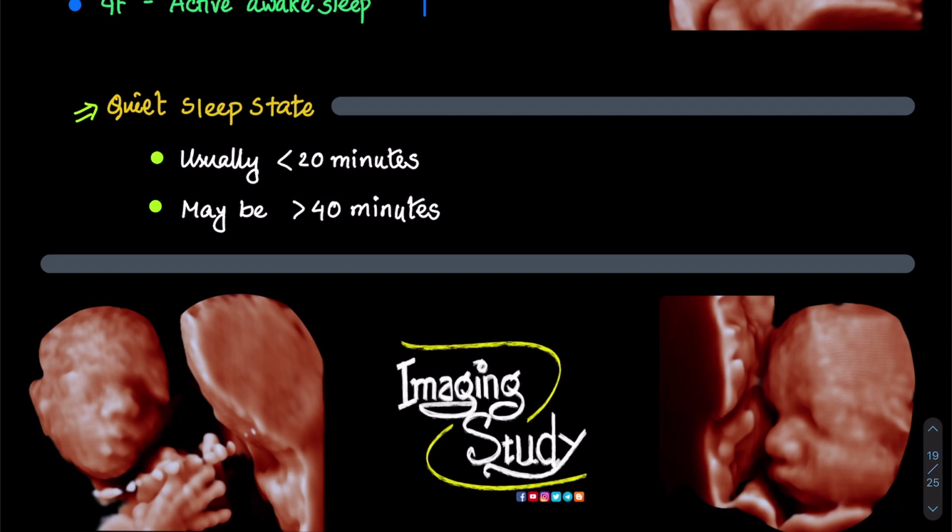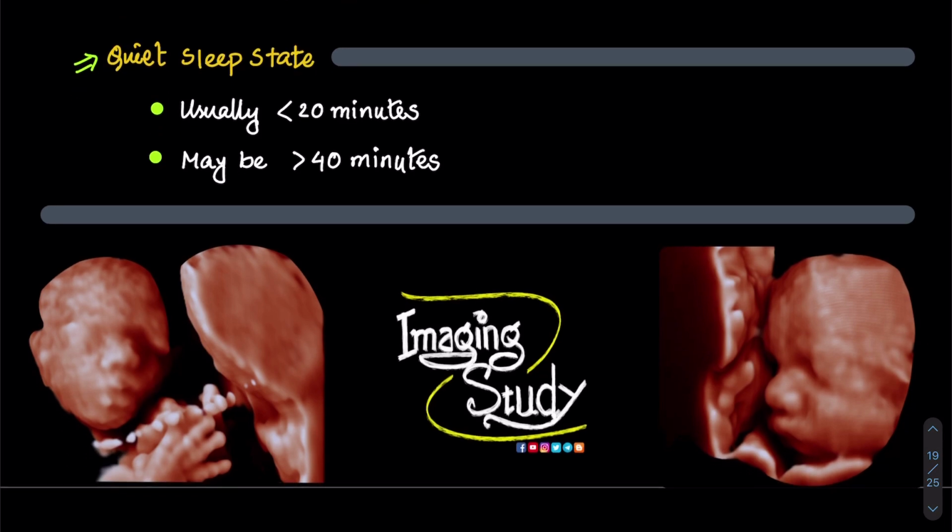John Patrick found that quiet sleep usually does not last more than 20 minutes. This is why the testing length of 20 minutes was initially chosen. But occasionally a normal fetus can frustrate the observer for more than 40 minutes. That's why we adjust the examination time to 30 minutes in general.